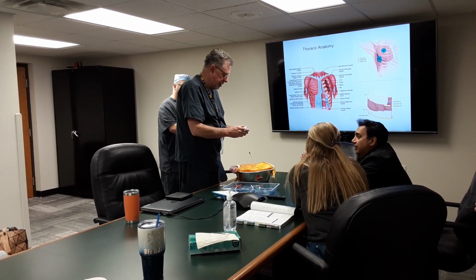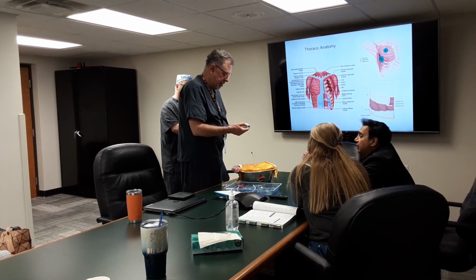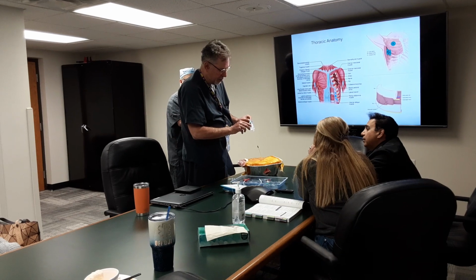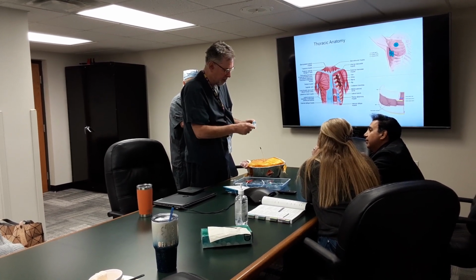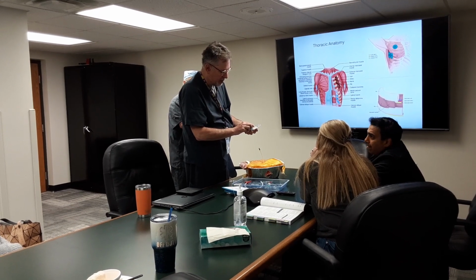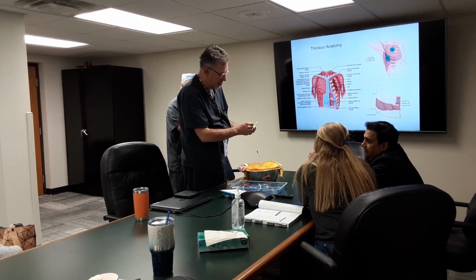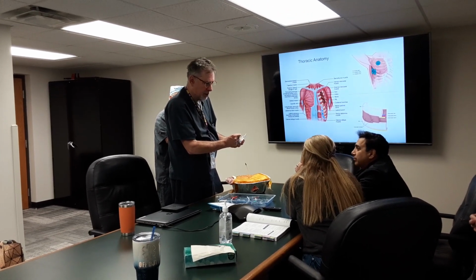And when you do this, it'll show you that the blue's going to go down. It's pretty easy because it shows you where flow is, so you want flow to go out, not in. There's an arrow that says that's the way flow's going to go. Another thing is, the way this works is, that's two pieces of plastic. Air goes through there, it can open, but then as it tries to draw back, it's really pliable, so it closes.